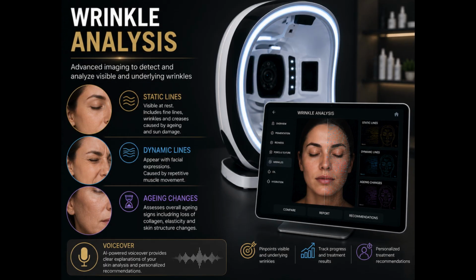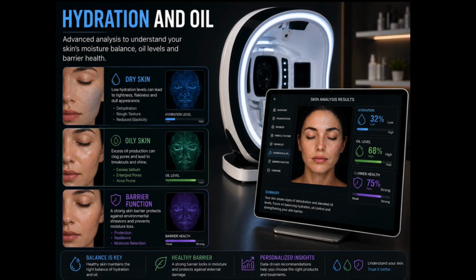Wrinkle analysis helps document aging changes and provides an objective baseline before treatment. Hydration and oil measurements may help guide skincare recommendations and monitor response to treatment.